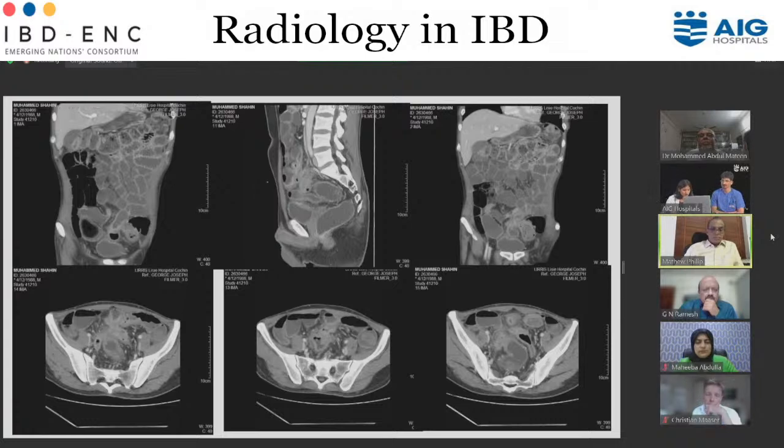Radiology colleagues, I do see a stellate pattern of arrangement of bowel loops in the pelvis, the first image in the bottom panel, with thickened bowel loops. And the top right image also shows one segment of bowel that's adherent to the urinary bladder. That's probably somewhere around there is where the fistula is. That's not really shown on these images. Yeah. And there's a lot of extramural inflammation, fat stranding, going on around the thickened bowel loops.